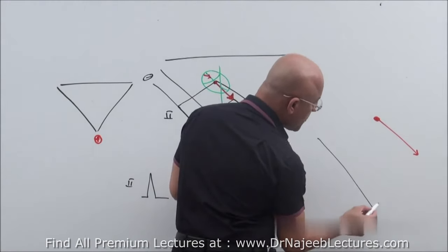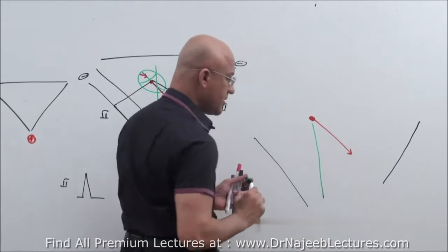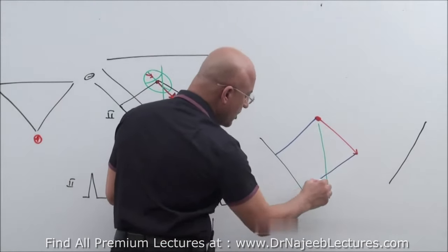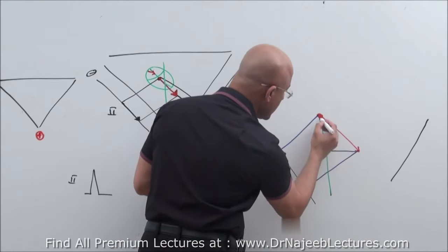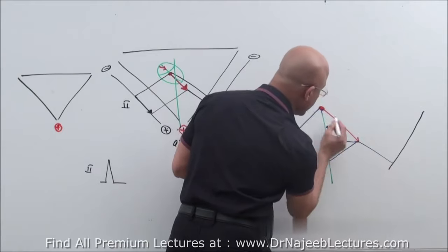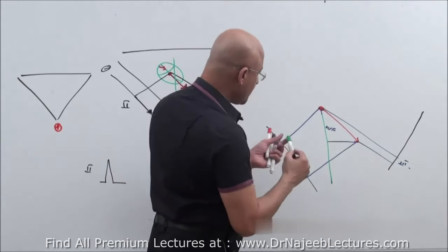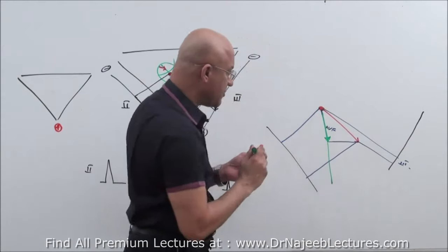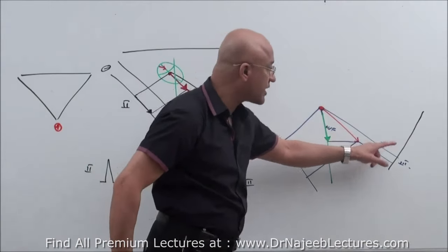Here is lead number 2, here was lead number 3, and here is AVF. Is that right? The maximum component of this was along lead number 2. True. A part of it is with lead number AVF, and a very small component was lead number 3. Now, this vector does project along the axis of AVF and also along the axis of lead number 2.